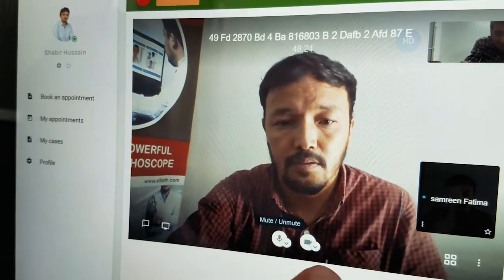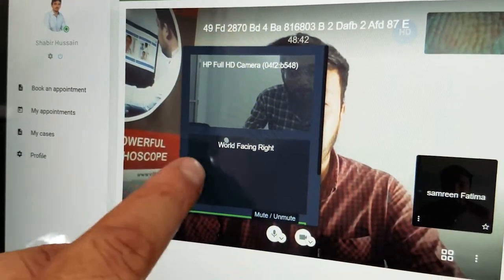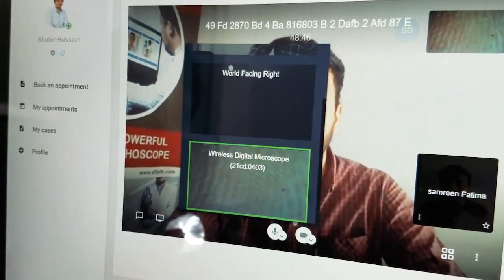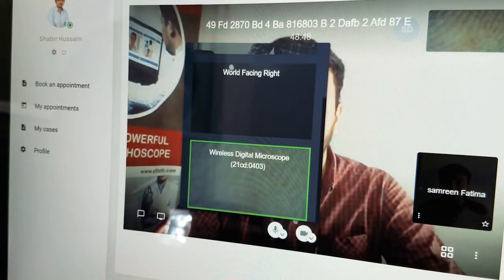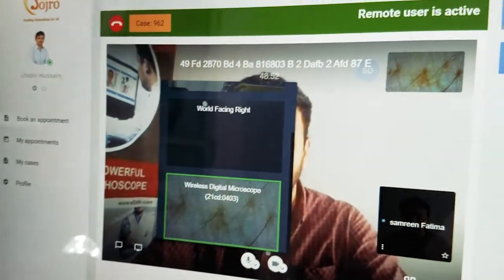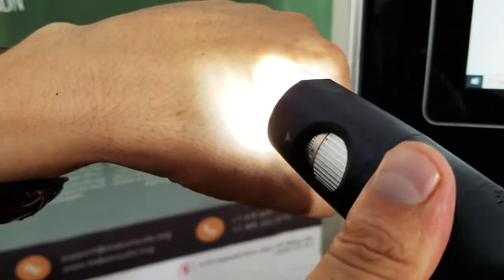As you can see, a dermatology camera has been connected. A skin image can be seen both at the patient end as well as the physician end.